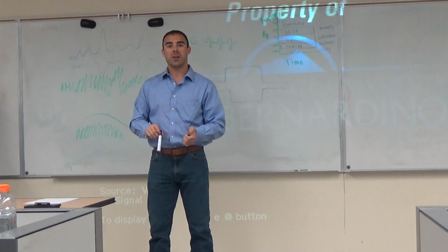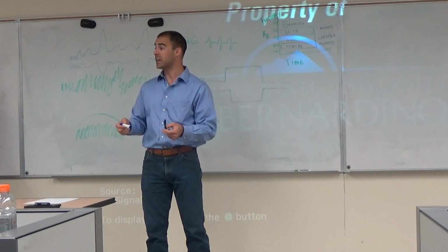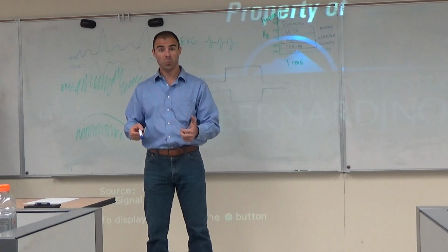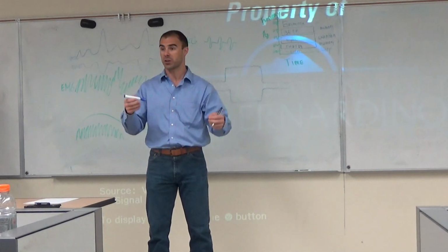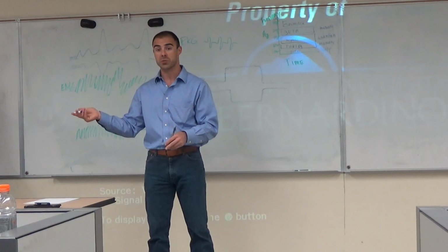One way that we get around that is the simple averaging process of the ERP. That's one of the whole ideas behind event-related potential averaging. We talked about it in biopsychology, we talked about it in behavioral neuroscience, and we talked about it earlier in class for this course as well.